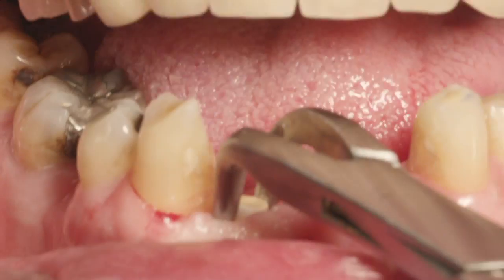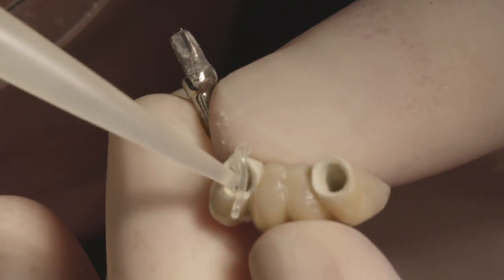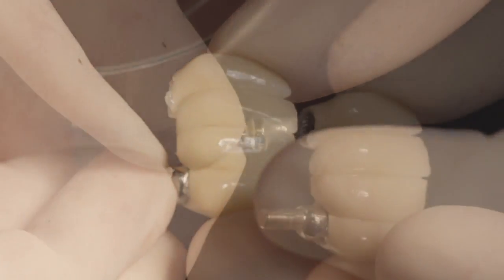Our demonstration begins with the removal of two white healing abutments. Vaseline is applied to the bores of the Trinia prosthesis, and the two milled abutments are incompletely inserted into the prosthesis.